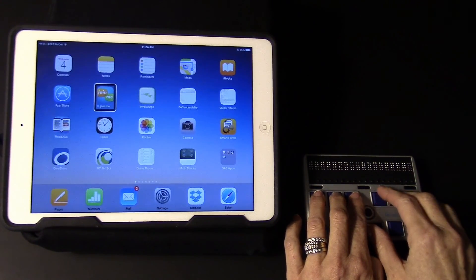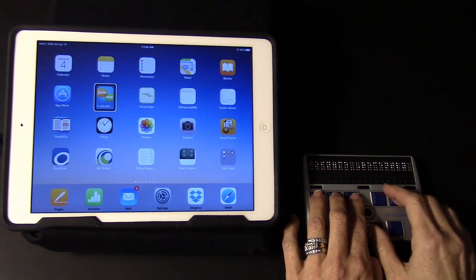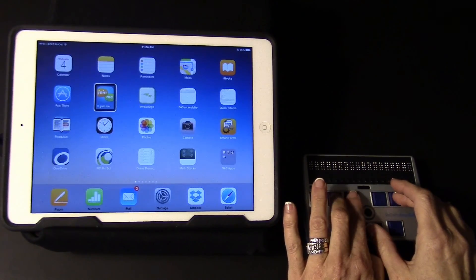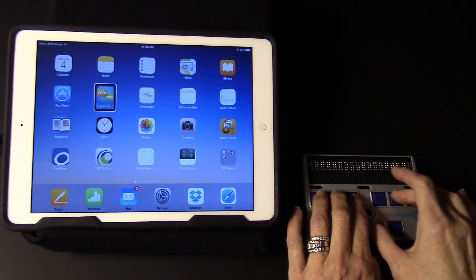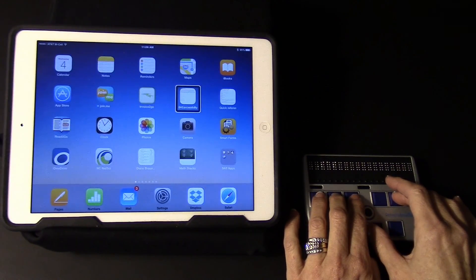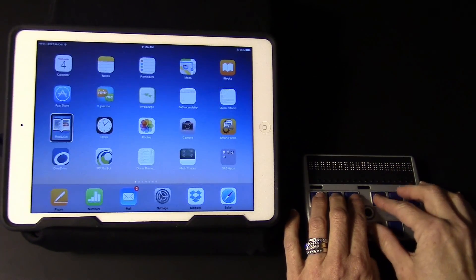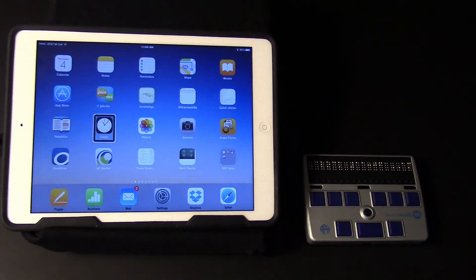To read all from the current location, I'm going to do R chord, which is dots 1, 2, 3, 5, space. The screen reads: Join.me recently updated, Invoice to Go, SAS Accessibility, Quick Reference, Read to Go. Pause with a P chord.